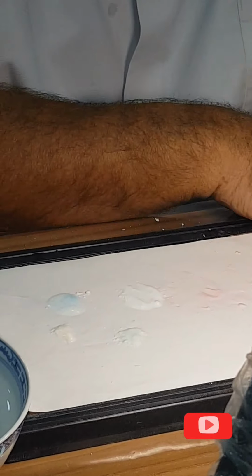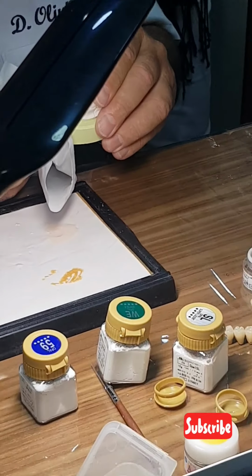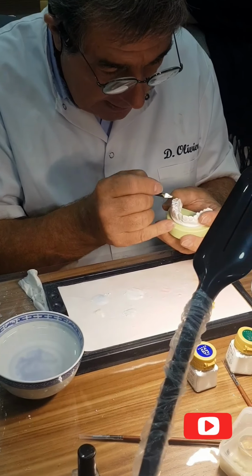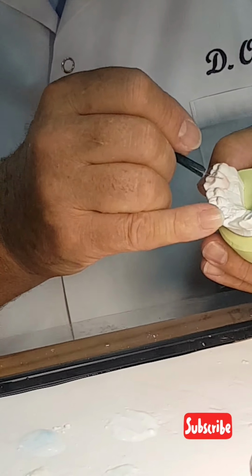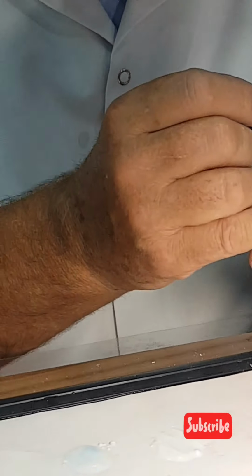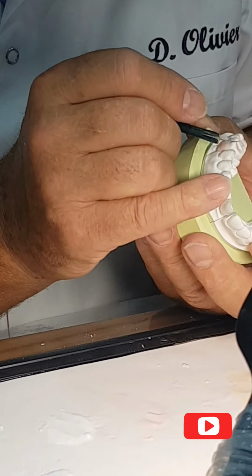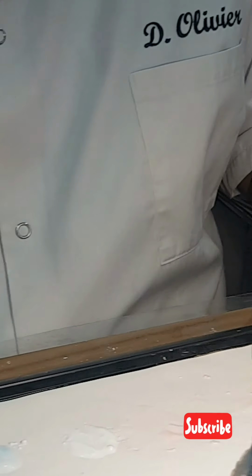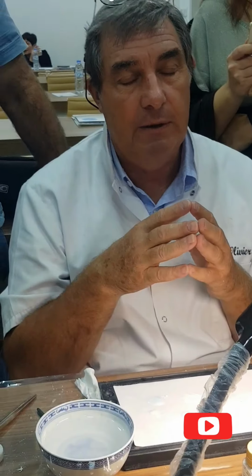Okay, and again, I work clean. What does it mean? For each layer, I want to have something perfectly clean. Why? The more I am able to separate the layers, the more I have the chance to obtain a good contrast, in fact, a beautiful ceramic.